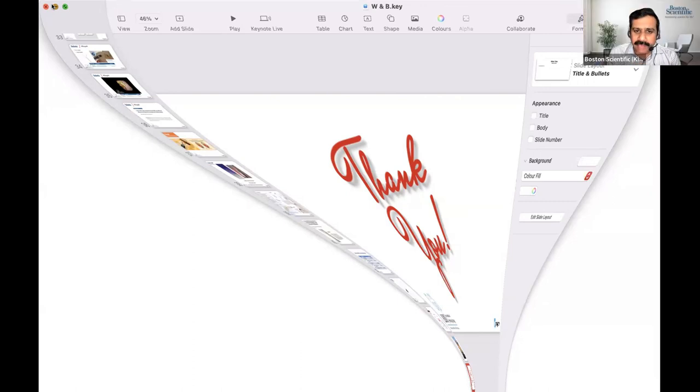So one more question we have: a zero-tip basket, 1.9 French with 120 centimeter catheter length. Can it be used for lower pole calyx stones? Yes, of course. Of course, we can use it. I don't see any reason why this particular size and length of the basket is mentioned here.